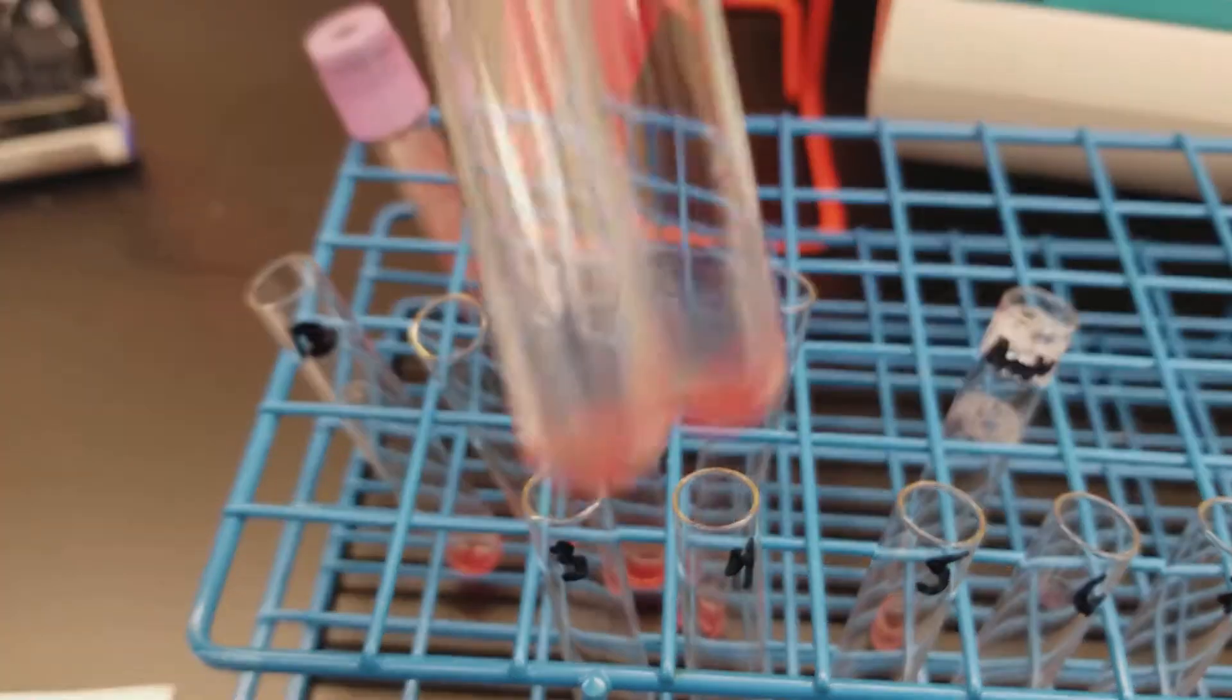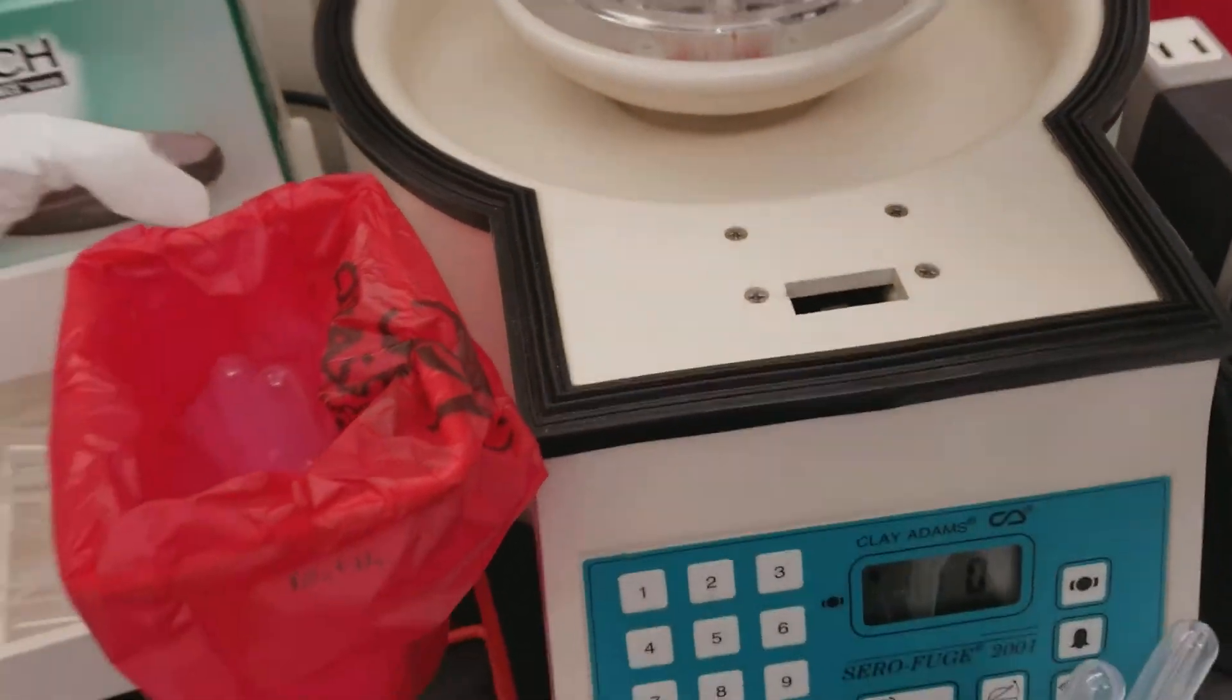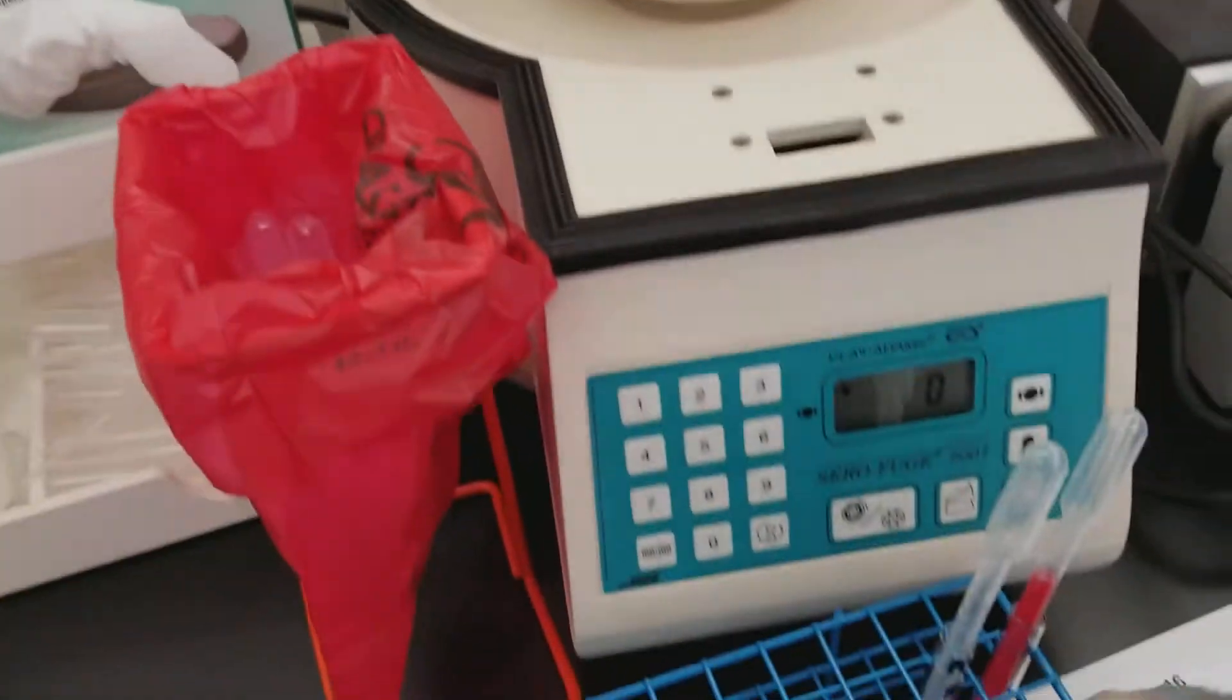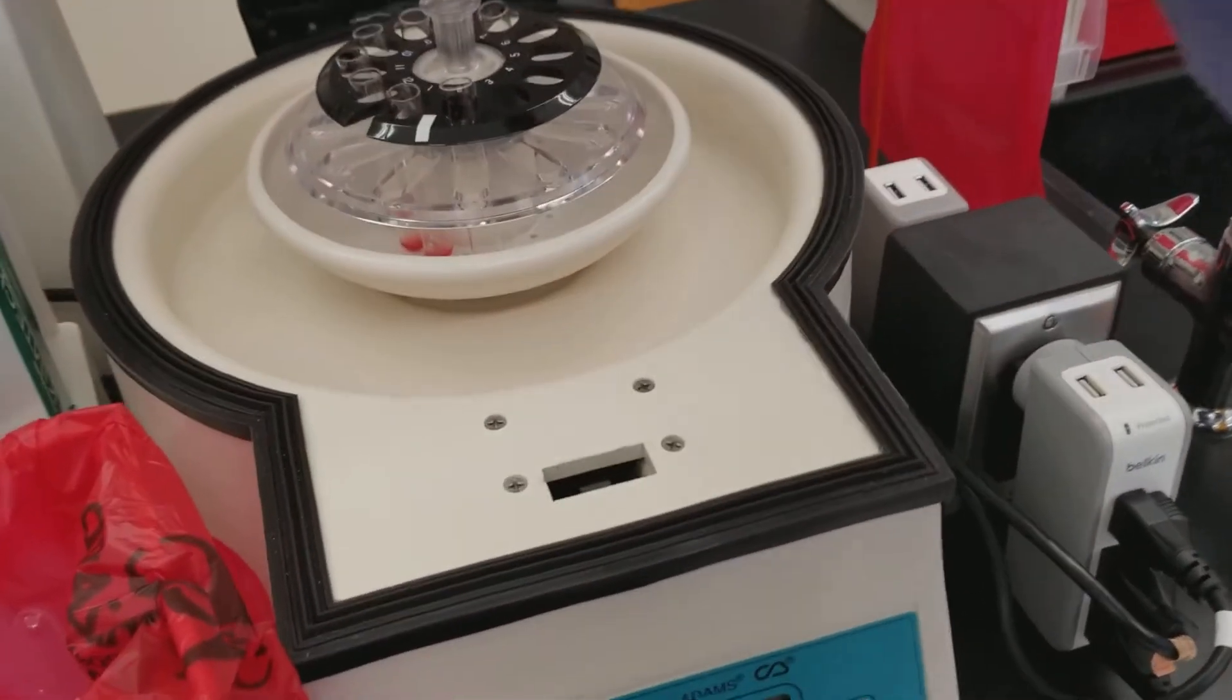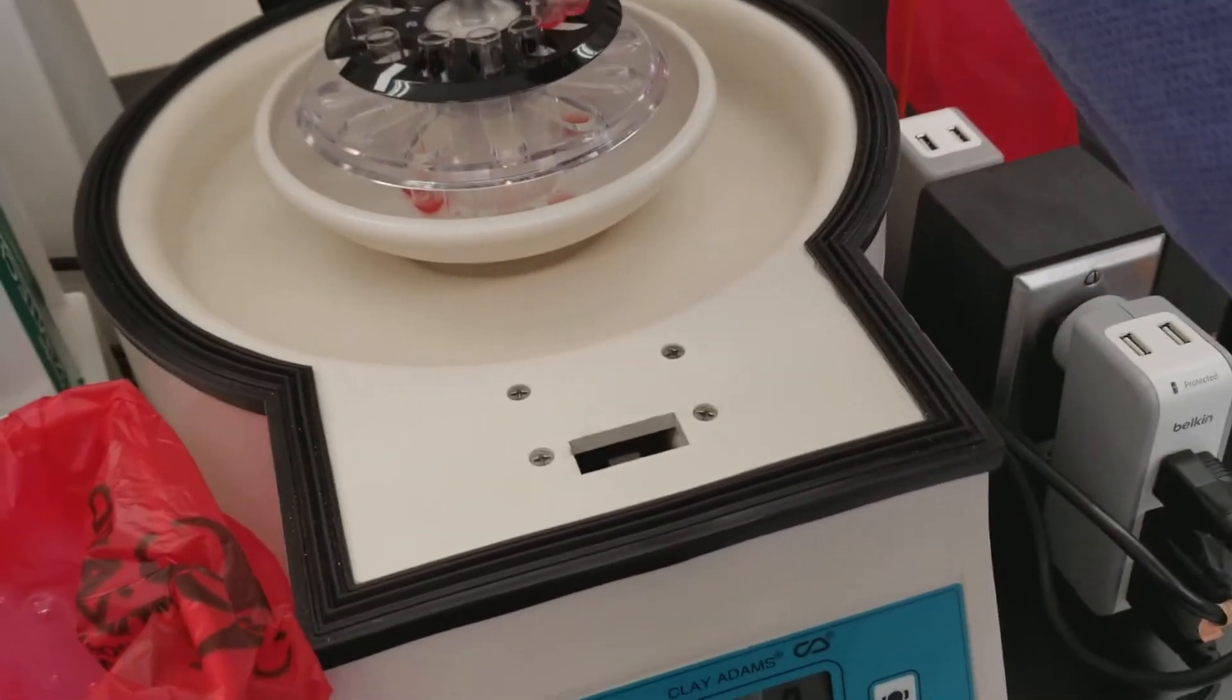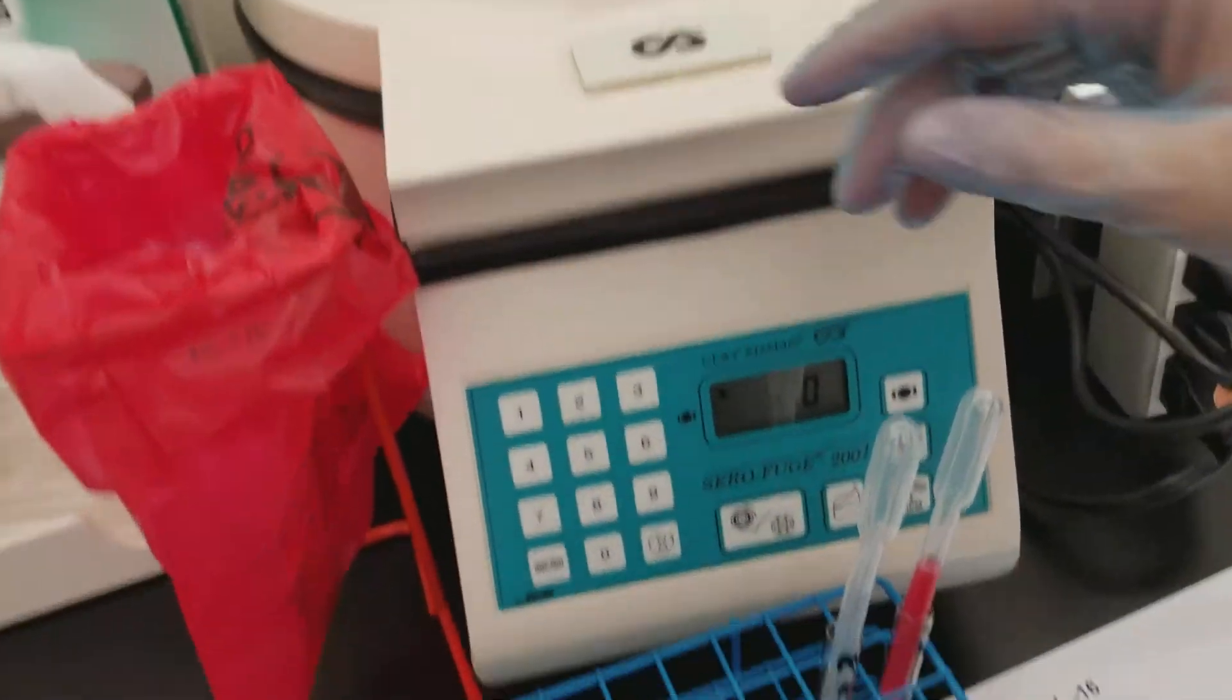We're going to now shake them a little bit very gently and put them into the centrifuge. And again, we're going to have to use two centrifuges because of how many tubes we have. I'll load the other one too off camera.